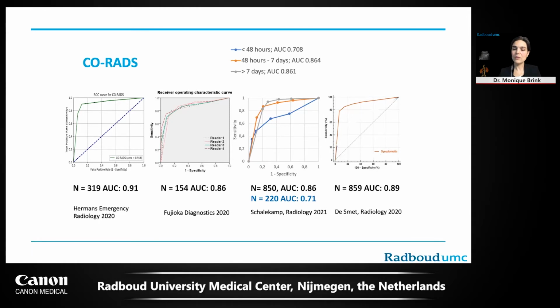And finally, the fourth study also investigated patients in a screening population, so the asymptomatic patients. And what they saw is that the area under the curve also dramatically decreases if you are using CT in these patients, for instance, just before they have to undergo an operation or something like that. And for this reason, and several other studies have been showing that as well, CT does not have much value in diagnosing COVID-19 in a screening population.